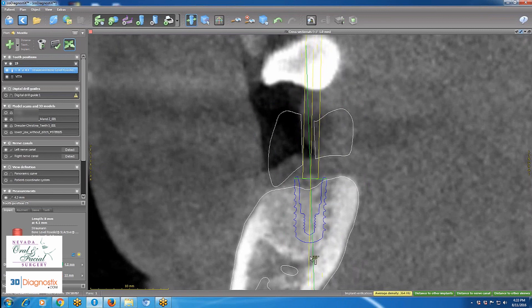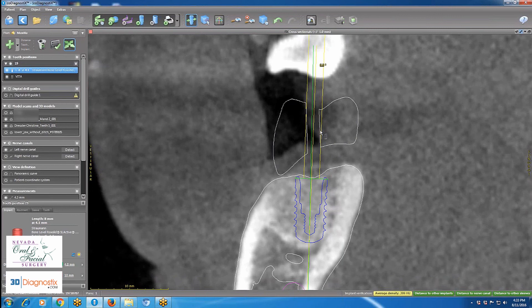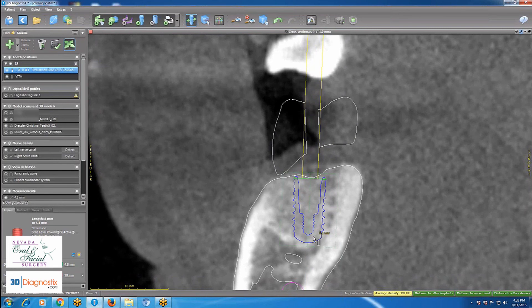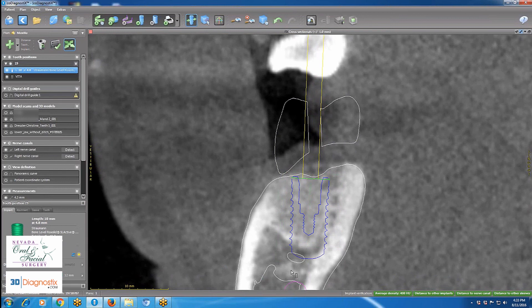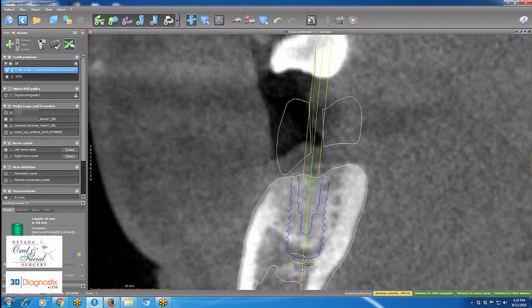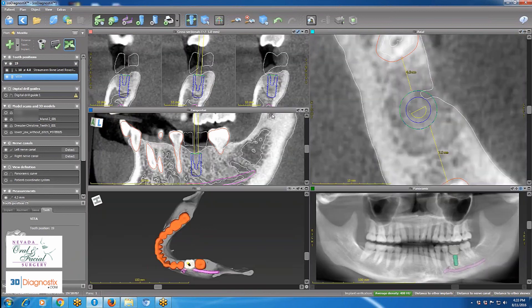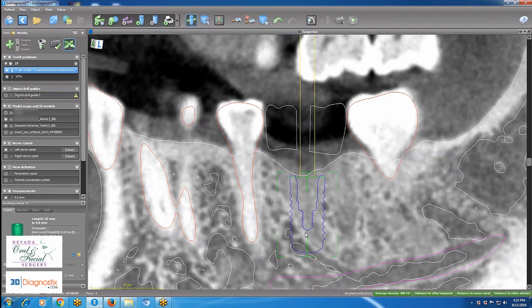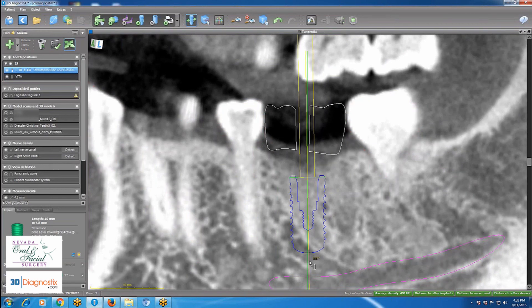I go to the cross-section view again — right-click and hold to change the angulation, left-click and hold to change the position. If I realize the implant could be wider or longer, I can change it using a shortcut to make it longer and wider, so I change it to a 4.8 by 10.